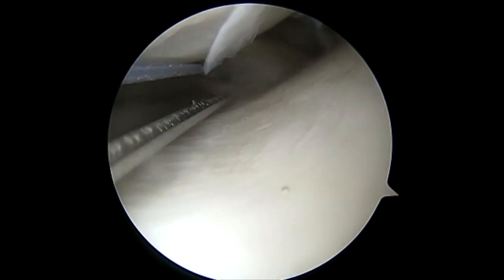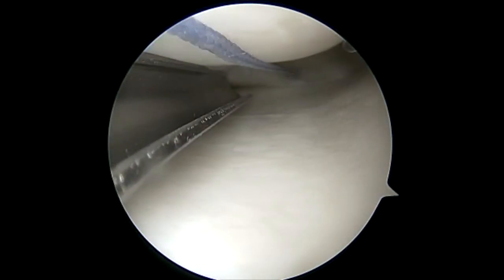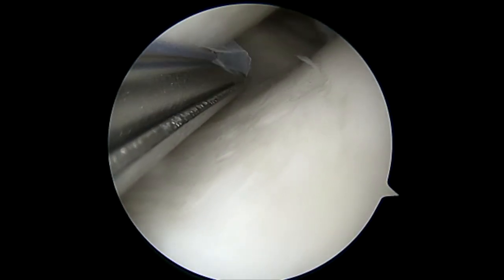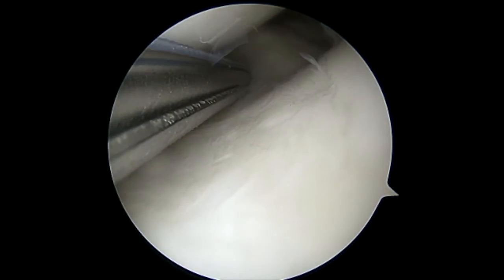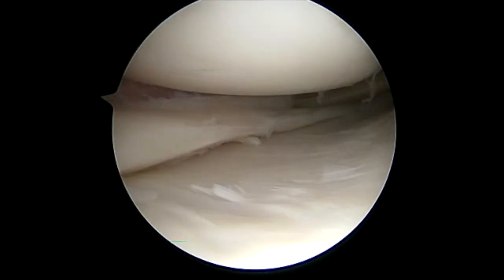This provides excellent pullout strength as well as compression. We use the tension cutter, and there are no knots on the surface of the meniscus for this type of implant. This also makes the inside-out repair much easier, as the meniscus will stay stabilized in its compartment.